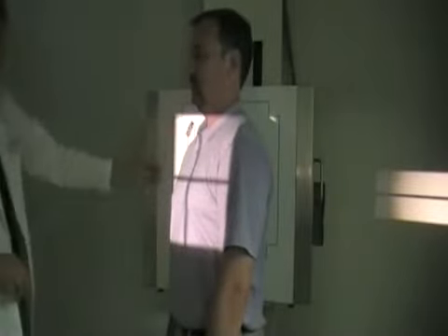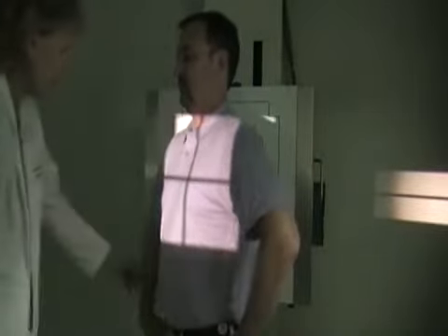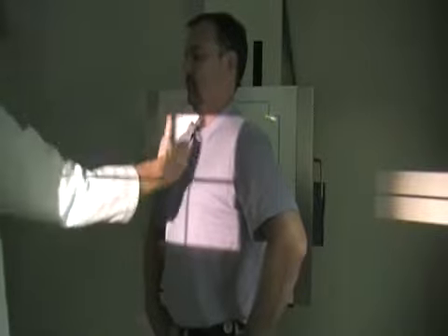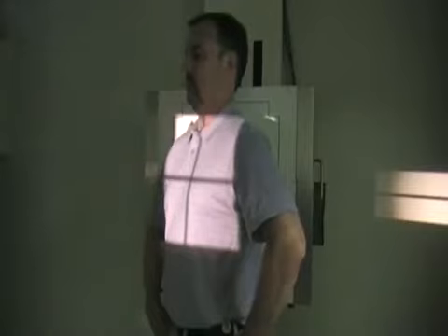For the right oblique, have your patient 45 degrees. Right side is touching. We're going to place our right marker up against here. Okay, and then I'm going to readjust, lean David just a little bit forward so that we can make sure that we are getting both sides of the lungs on. So you want to check your light field, and it's going to look like this: longitudinal light is on the upside from the midpoint of the chest. But it's really important we do include both lungs on this.